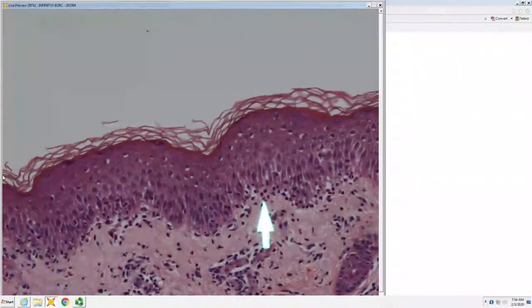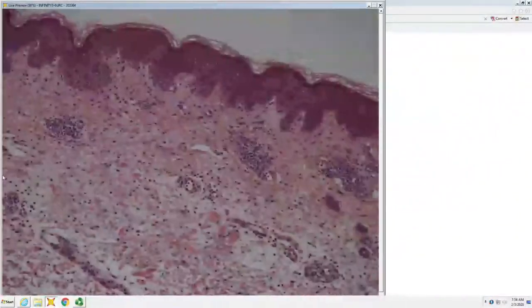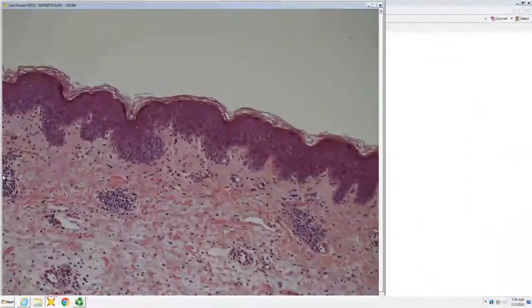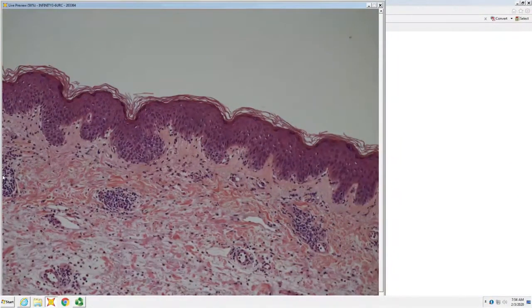Interface, and what kind of cells are at the junction? Eos and neutrophils, single file at the DE junction. What could that be? Urticarial BP. Yeah, so urticarial phase of BP, or anytime you say BP, you also have to say EBA. Right, so it could just as easily be urticarial phase of epidermolysis bullosa acquisita. And this one was BP, just as you suspected.